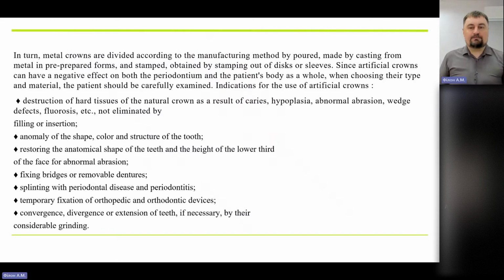So that is what I want to say. We still have time, and what I can add after all of this. Nowadays, a lot of these crowns are not used. Metal stamped crowns, plastic crowns, are used just as a temporary for the temporary treatments.